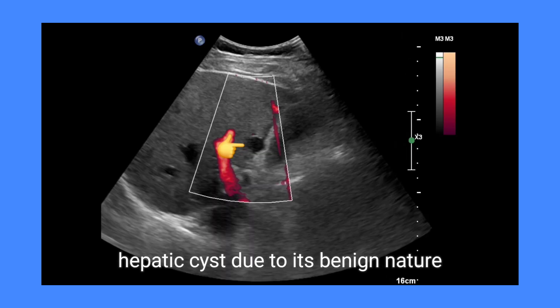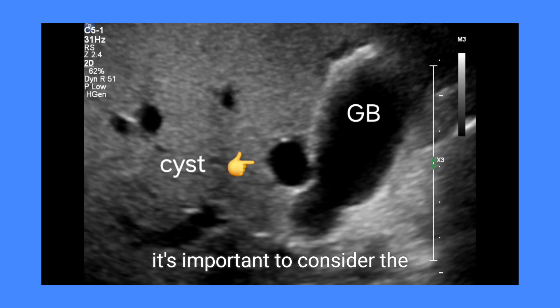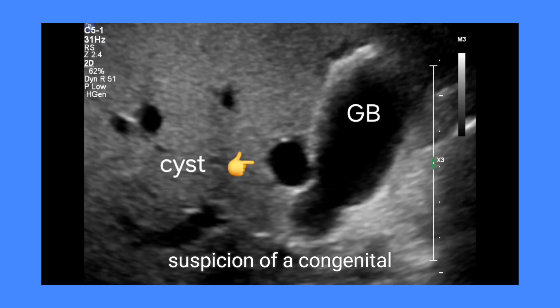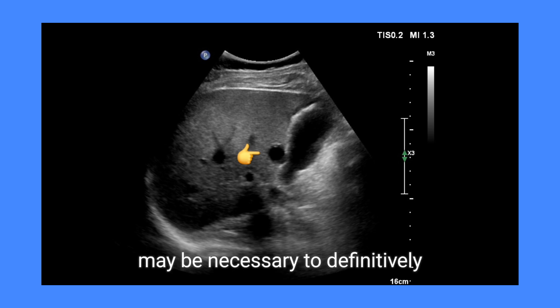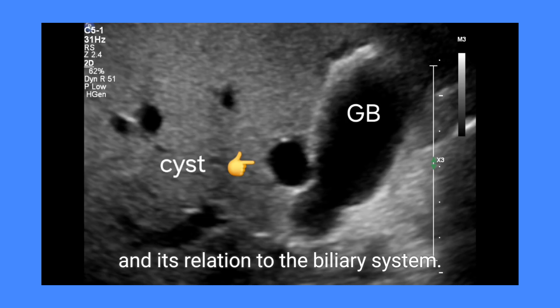The most likely diagnosis in this case remains a simple hepatic cyst due to its benign nature and typical appearance on ultrasound. However, it's important to consider the possibility of a choledochal cyst, particularly if there is any suspicion of a congenital anomaly involving the biliary system. Further imaging, such as MRCP, may be necessary to definitively characterize the lesion and its relation to the biliary system.